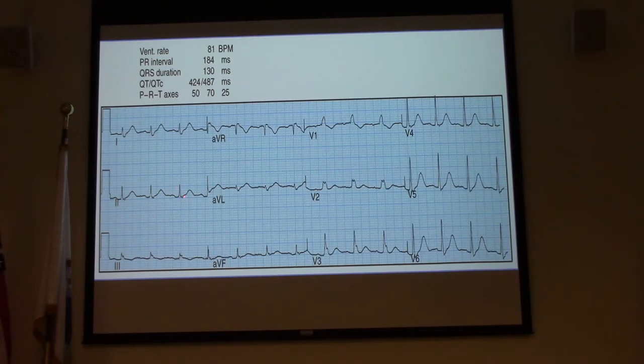People look at this and say, oh, this looks like elevation here. That's not elevation, that's actually an R-R prime. There's so many things that when we look at them, and the big reason to bring a lot of this to your attention is because you guys will call us and say, we called a STEMI, we saw elevation, they didn't believe us. But a lot of the STEMIs or elevations you're seeing could be one of the STEMI mimickers, which we're going to talk about in a little bit. And it's hard to recognize those unless you fully understand what a 12 lead is telling you.